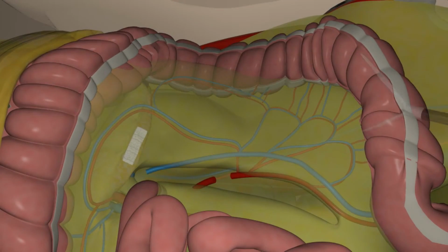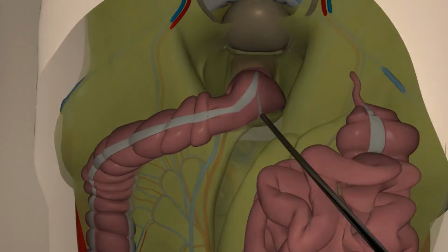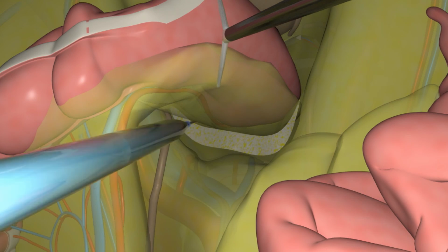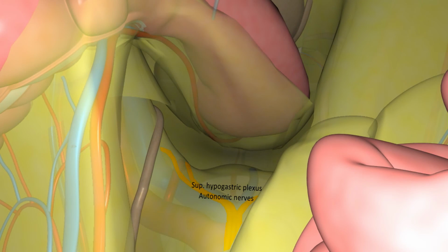Attention then turns to the lower attachment of the rectosigmoid, and cautery is used to open along the lateral side of the upper mesorectum. The dissection of the upper rectum should proceed with caution because the hypogastric nerves are tented upward and may be inadvertently injured. These nerves may be swept posteriorly before dividing the soft tissue in this area.